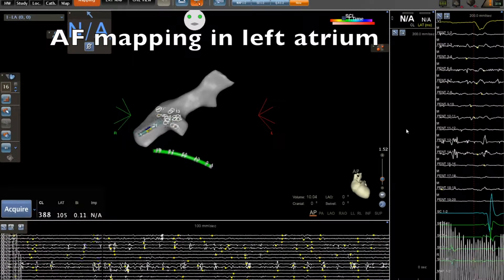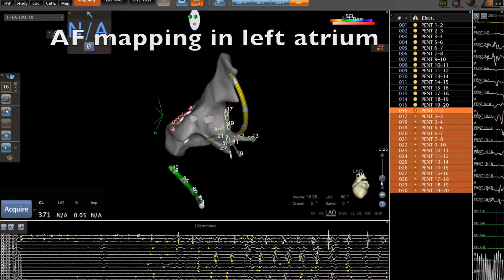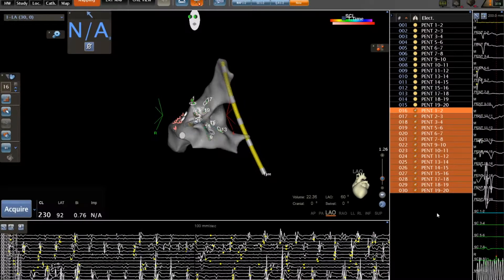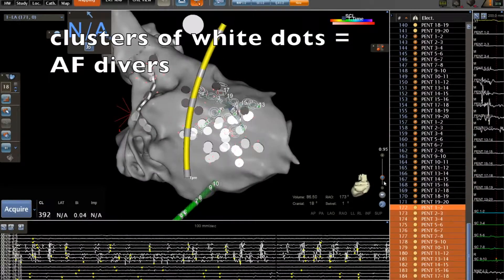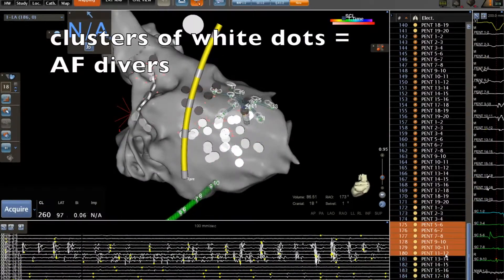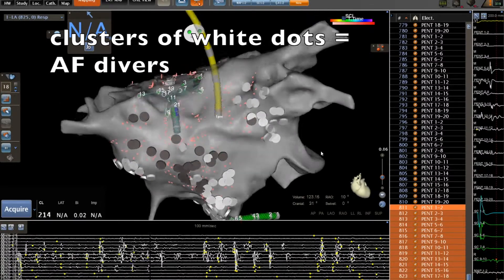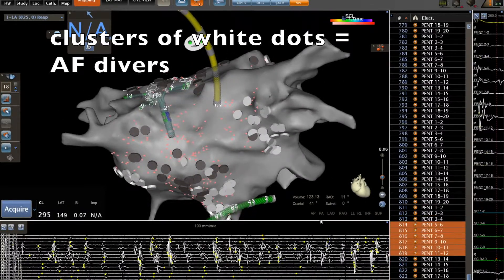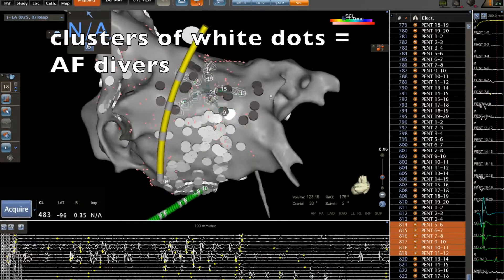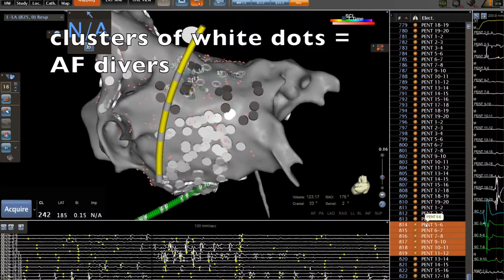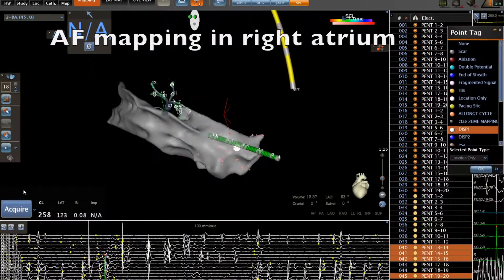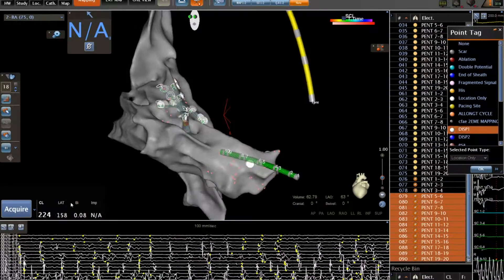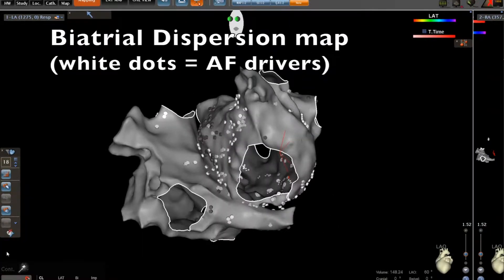We start the procedure by performing the AFib mapping using a multi-electrode catheter. We visually tag in the left atrium geometry clusters of white dots. These clusters correspond to AF driver areas. Then we perform exactly the same mapping in the right atrium in order to obtain a bi-atrial dispersion map.